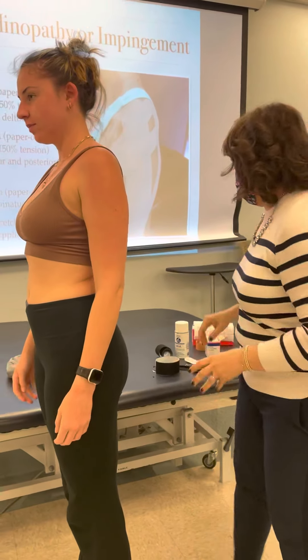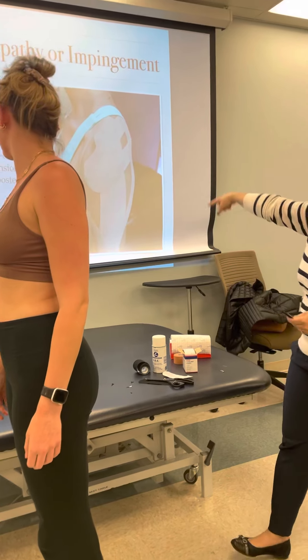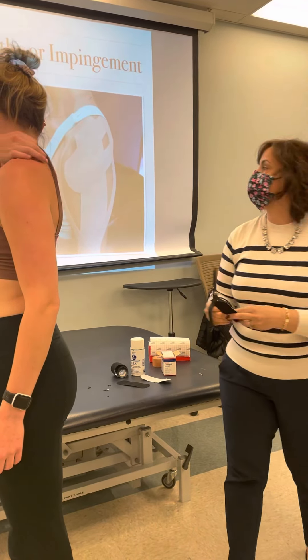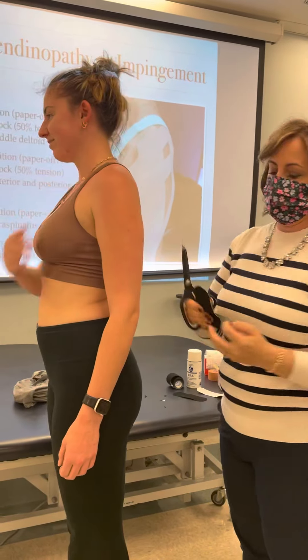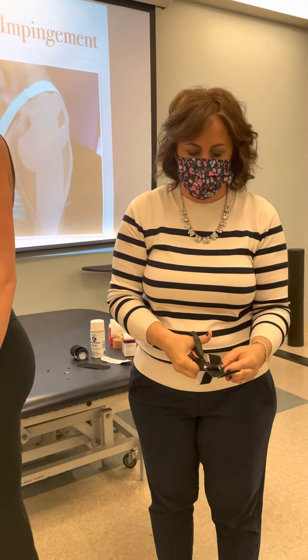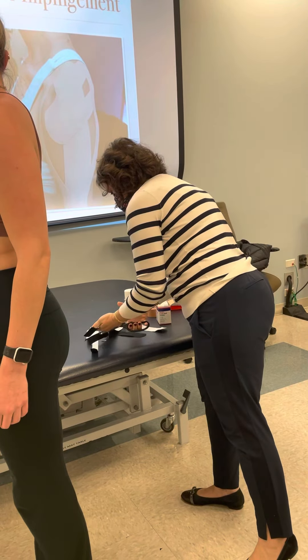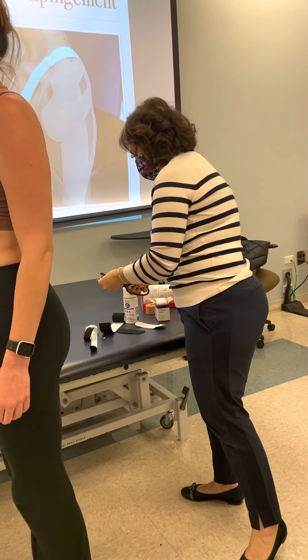This one is just a little different in how I got there. You still see the strip up the middle and then the front and back piece, but what I did differently here — because this was a very petite shoulder — is I ended up splitting this into a Y-strip and used an I-strip. Let me just kind of show you that real fast. I put it in the notes there for you to remember.